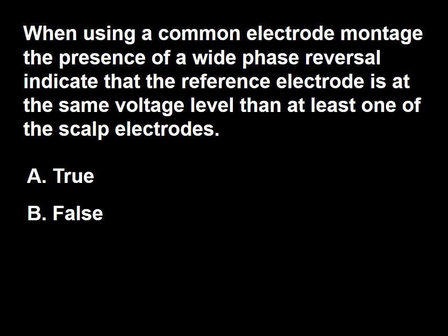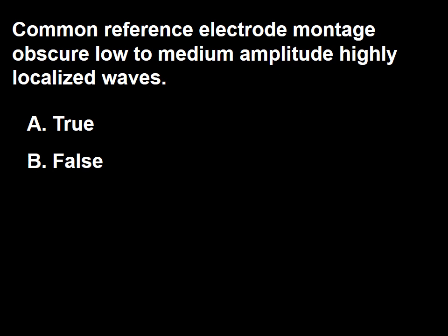So the answer to this question is true. Next question. Common reference electrode montage obscure low to medium amplitude highly localized waves. A, true, B, false.